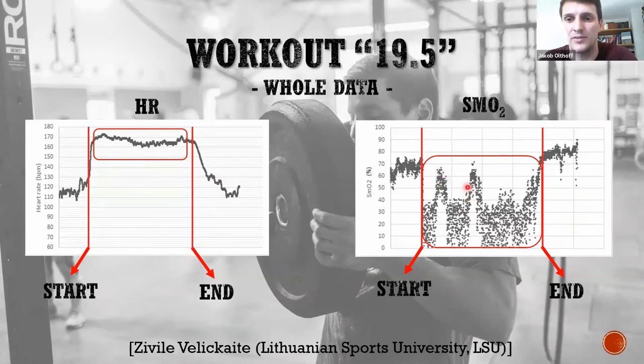Those peaks we have here, it's clear that we have a bigger amount of lower saturation levels down here because this guy was working out. But the interesting things are those recoveries here, and why this was, that is a good question. We didn't simultaneously capture the data and film the workout. This would be a next step, to see what actually happened during that phase of SMO2 recovery.